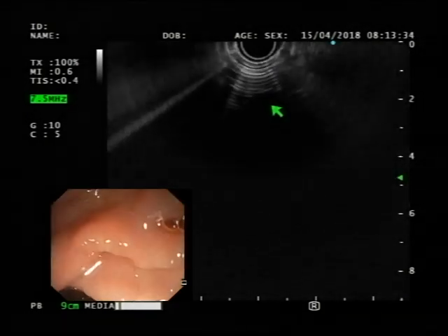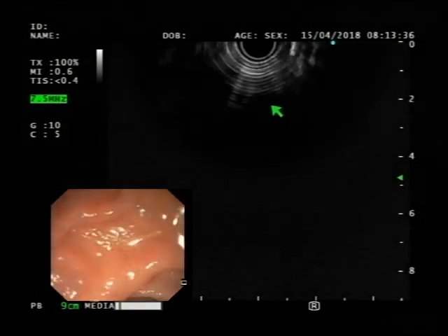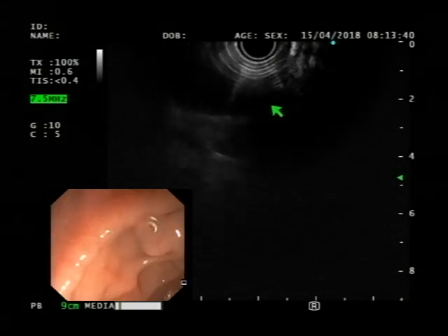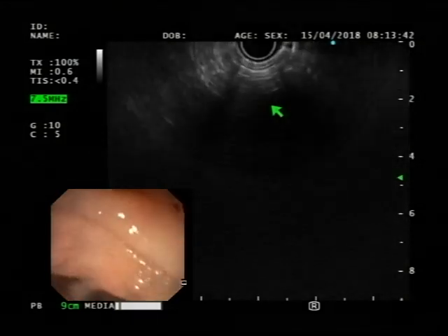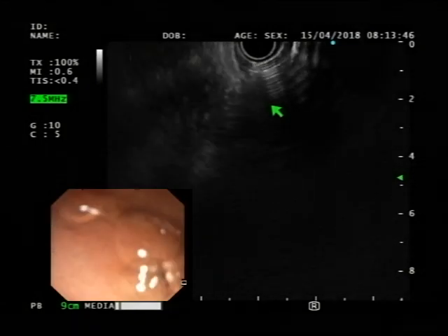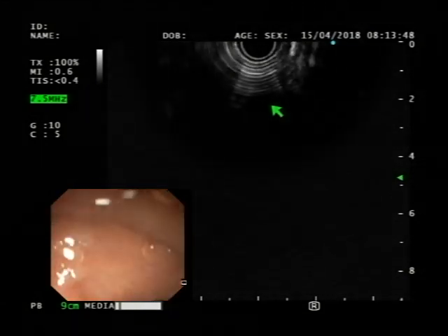Okay. Either we can see the papilla and put the transducer on that, or okay. Now maintain this, you are falling back repeatedly. Okay, fine. So big wheel towards you. Big wheel towards you, please. Okay, suction the air.